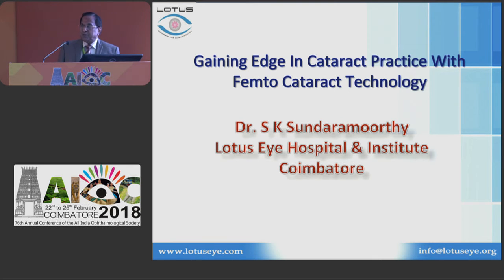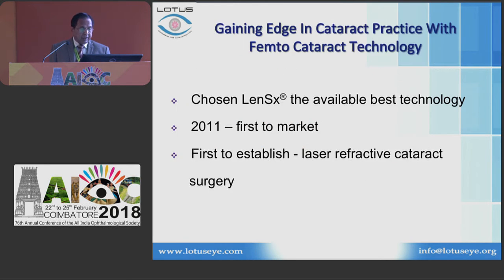I'm going to take a few minutes to discuss the technology, how you gain an edge in your cataract practice. I'll take you through, so please pay attention for a few minutes. What we need at this moment, when you want to gain an edge in cataract practice, is to have a good technology and technique. Next, you need to know what benefits you are getting from this technology. I'm going to narrate to you one by one the advantages of this particular technology.